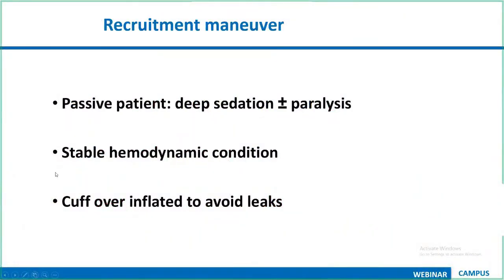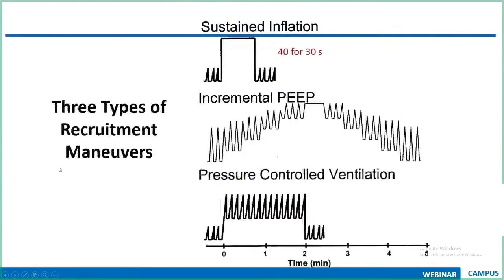For recruitment, the patient should be passive and deeply sedated. Paralysis is not always necessary. The patient should be hemodynamically stable, and the cuff should be slightly more inflated. We have discussed this also last time.